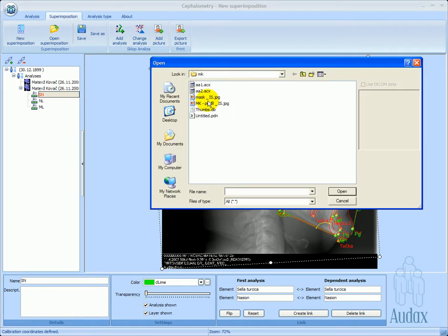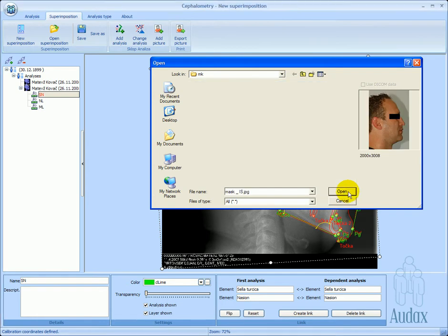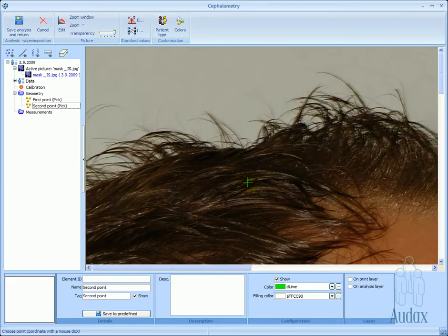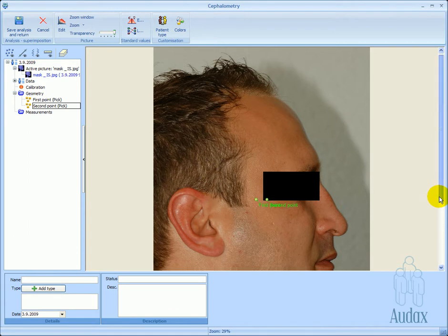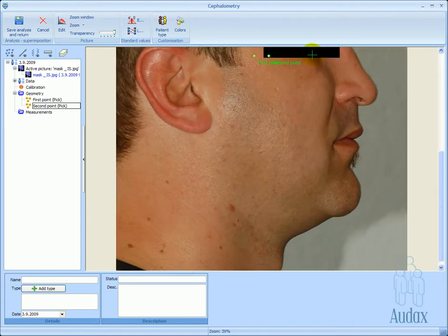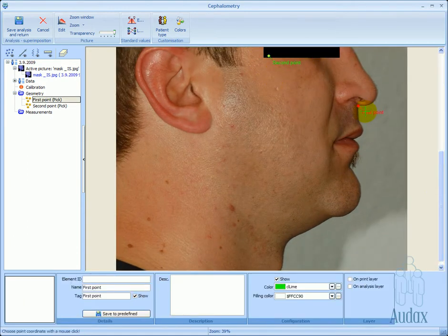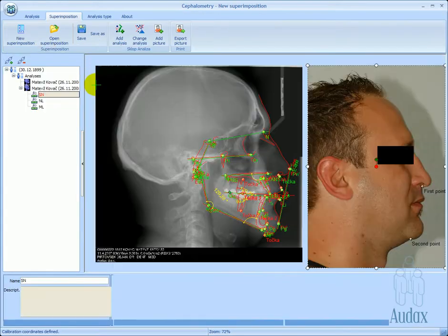The patient's image can also be added to the same assembly. We define two landmarks on the soft tissue that are also visible on the x-ray image, and simply link them to the analysis.